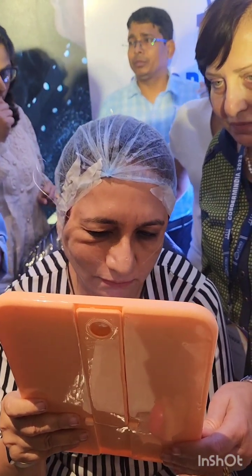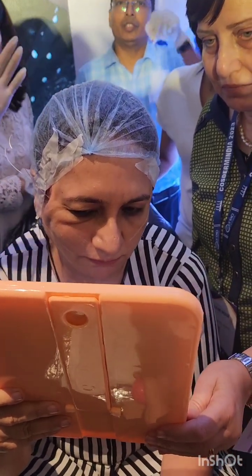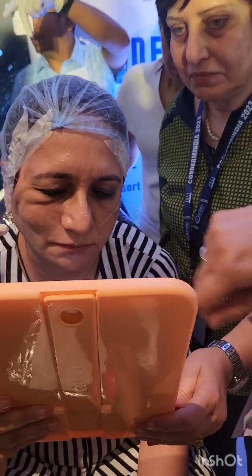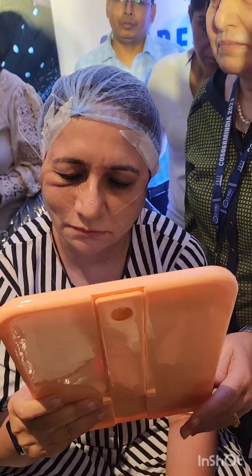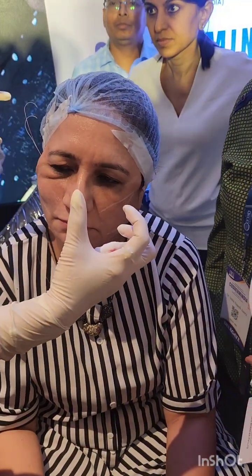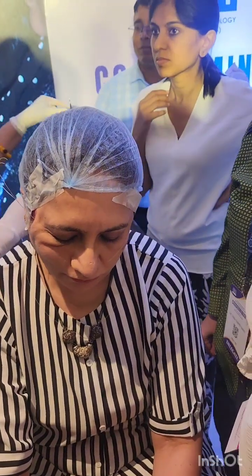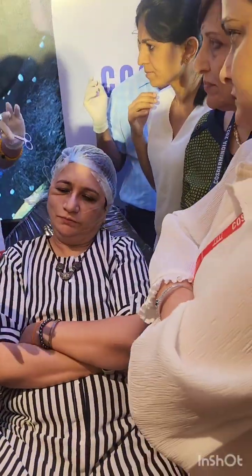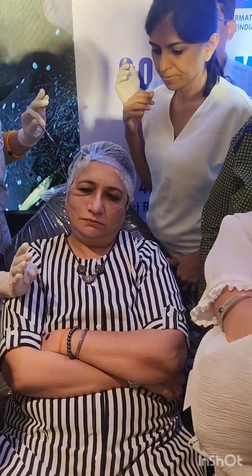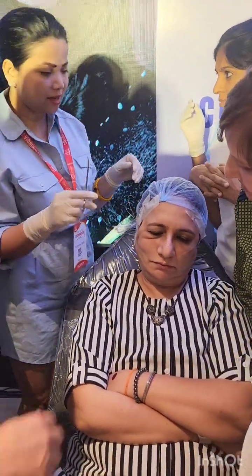This is a sign that she is going to get a very good result, because fat is like a liquid. It's not a solid thing that you have repositioned and it is going to be there forever. Like it with just a little massage you can do, but that will obviously relax the skin. So ma'am, do you want me to release or you can stay within your mask for 5 to 7 days? You can stay? Okay. That will be better. I can do it after the procedure also. And who is your doctor? Neetu. So she can also relax it. It can be relaxed even after 15 days of the treatment.